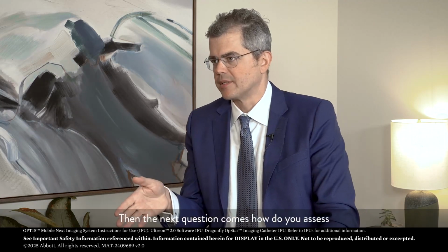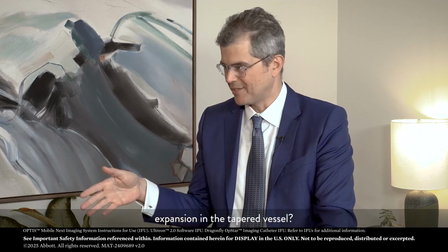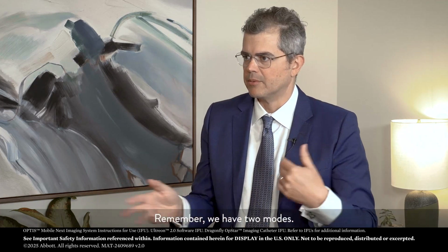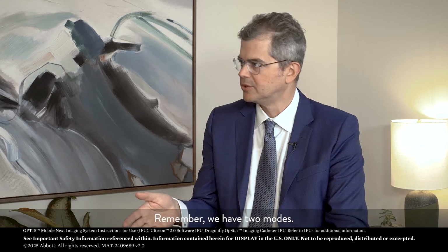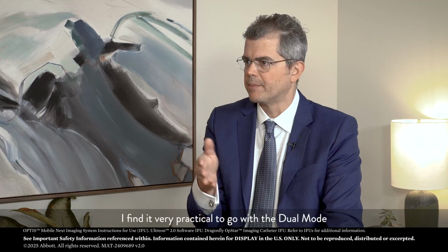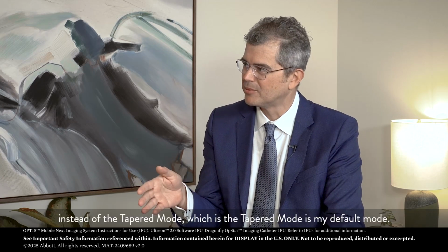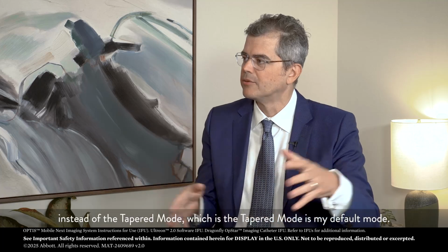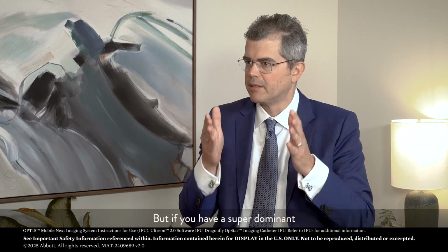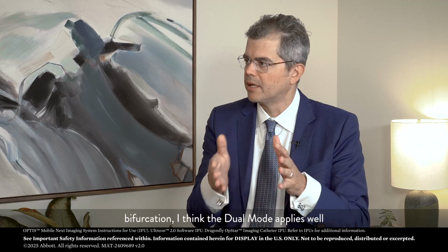Then the next question comes, how do you assess expansion in a tapered vessel? Remember, we have two modes. If you have a very dominant vessel, I find it very practical to go with the dual mode instead of the taper mode. The taper mode is my default mode, but if you have a super dominant bifurcation, I think the dual mode applies well.